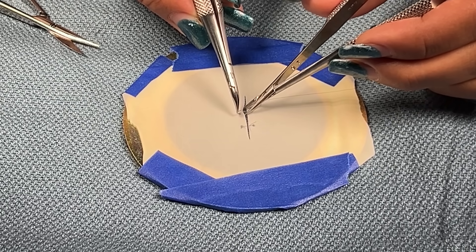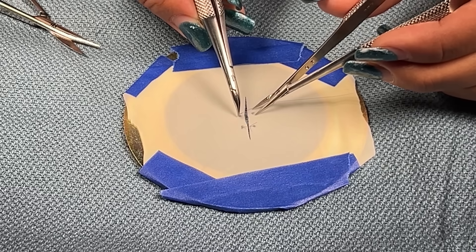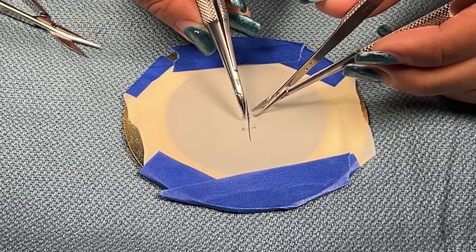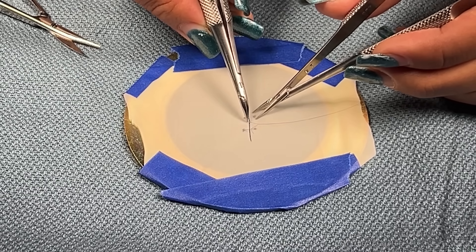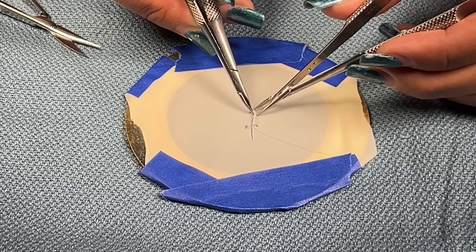As I locate the tip of the needle, I'm going to stabilize the far flap. Counterpressure and drive, rotate to drive the needle through.